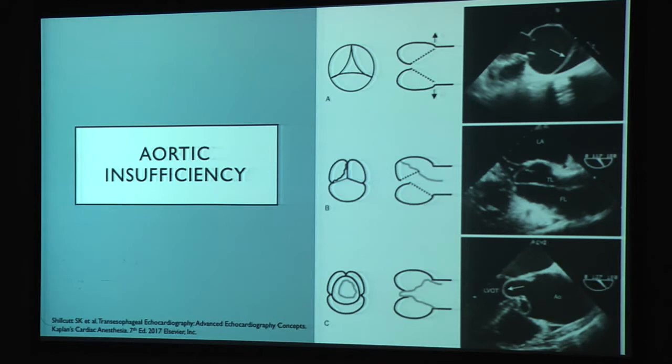Aortic insufficiency, so there's kind of three different types that we're going to have here. We have type A there, where there's incomplete closure when the STJ dilates. And you can see this is because the annulus is open and you can't have closure of the valves, and you're going to have aortic regurgitation there. Type B there, in the second one, you can see that the flap is preventing the opening or fully closing of one of the valves or one of the cusps. And then the following one is when it kind of projects between the cusps of the aortic valve and has an impact there.